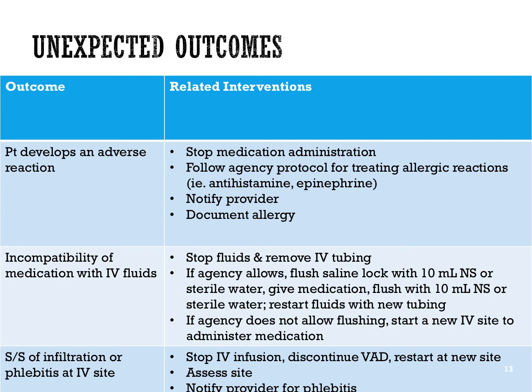Okay, so it's also important to look at unexpected outcomes so that we know what to do if they occur. If a patient develops an adverse reaction, if they start to develop signs and symptoms of an allergic reaction while we are administering a medication IV push, of course you want to stop that medication right away. You want to follow the agency's protocol for treating allergic reactions, which might include the administration of some type of antihistamine or epinephrine. We'd want to notify the provider and document the allergy to the medication.